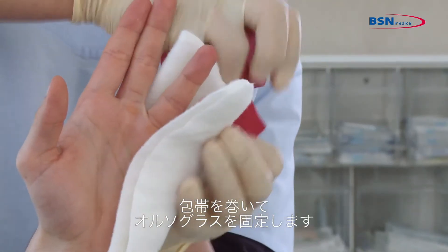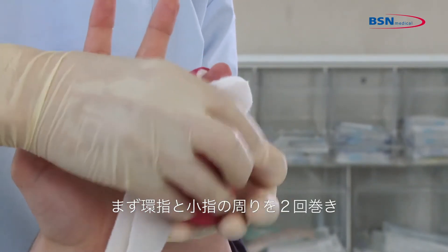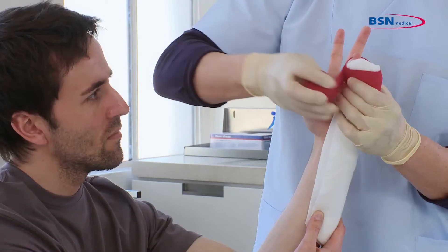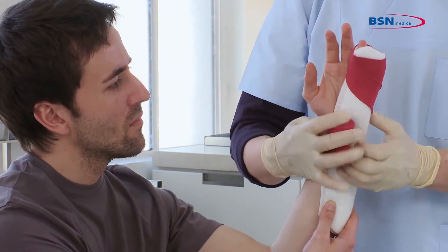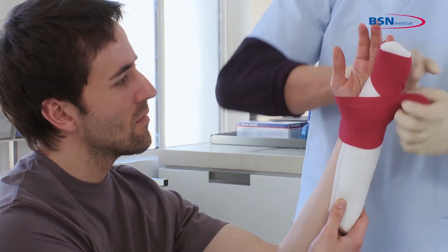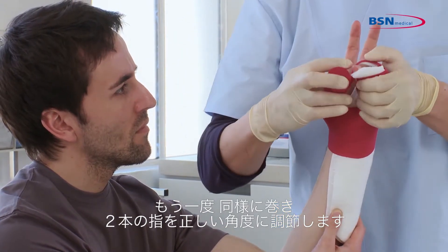To secure the splint, wrap a bandage around it. Start wrapping around the fourth and fifth finger two times and also continue around the wrist twice. Repeat this step again and position the two fingers at the right angle.